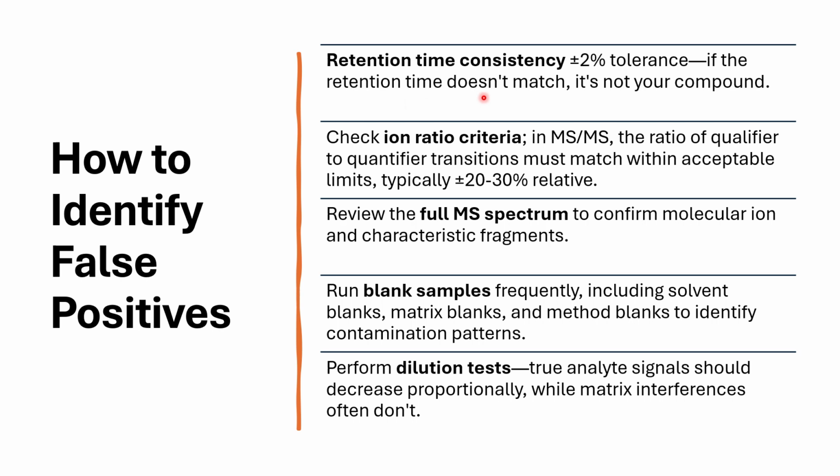Retention time. Verify retention time consistency against your authentic standard within plus minus 2 tolerance. If the retention time doesn't match, it's not your compound.